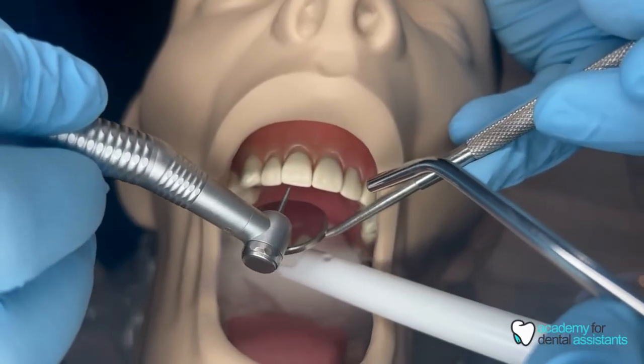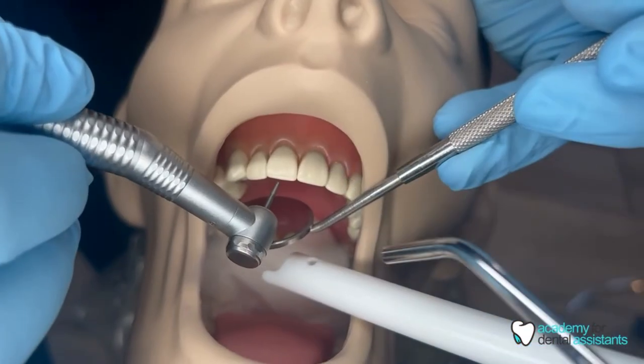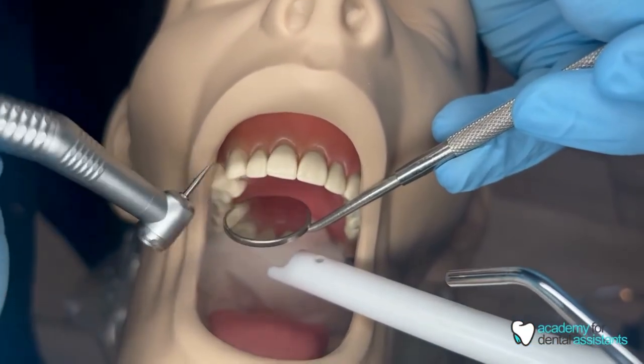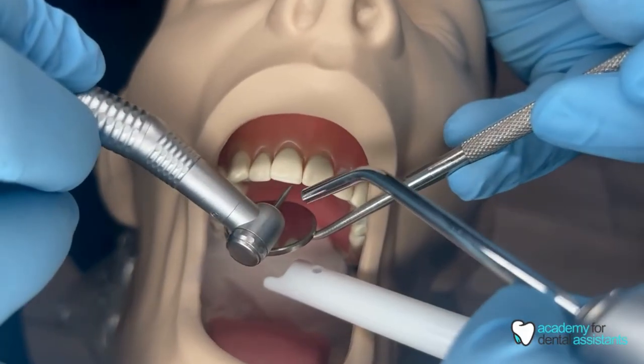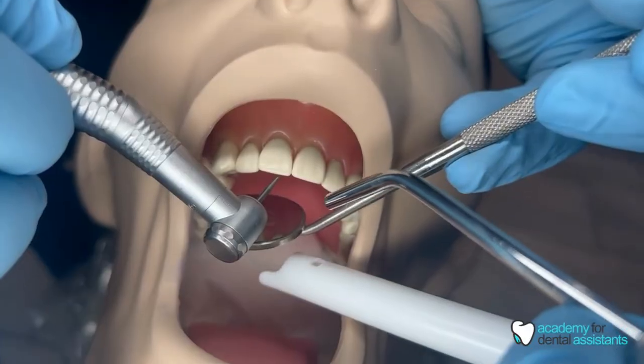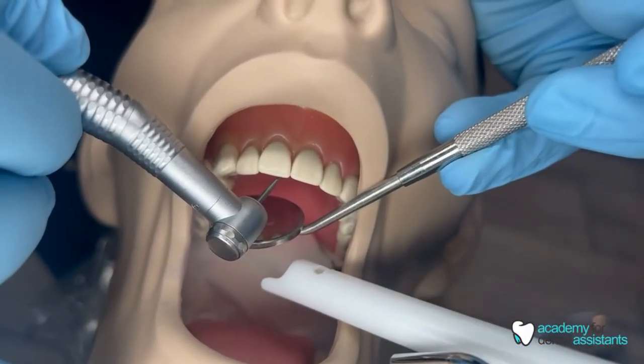If the doctor was working on the lingual side of number eight, they would have the mirror there to see the lingual side for indirect vision. You want to make sure that your HVE is not in their way, but right there underneath the mirror to catch any extra debris.